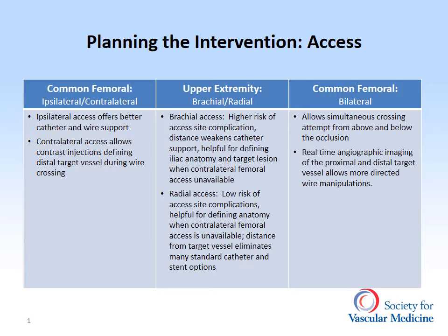With respect to bilateral common femoral access, this approach allows simultaneous crossing from above and below the occlusion. Real-time angiographic imaging of the proximal and distal target vessels also allows more directed wire manipulations.